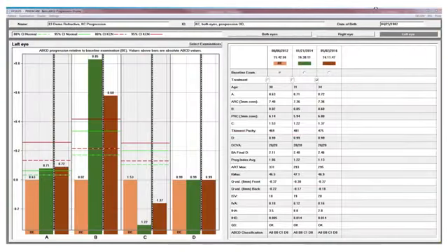A new feature from the OCULUS Pentacam is our keratoconus progression display. This is designed to look at several measurements over time, including anterior curvature, posterior curvature, corneal thickness, and best corrected visual acuity, and look at these over time in order to assess whether or not the patient is progressing.